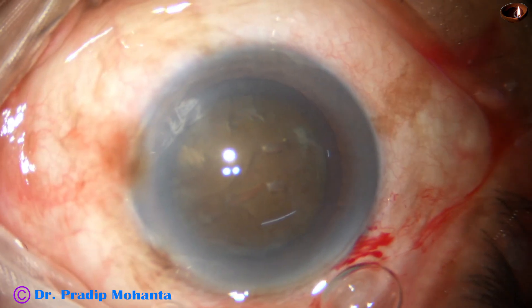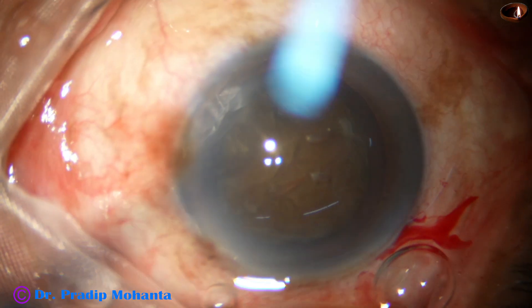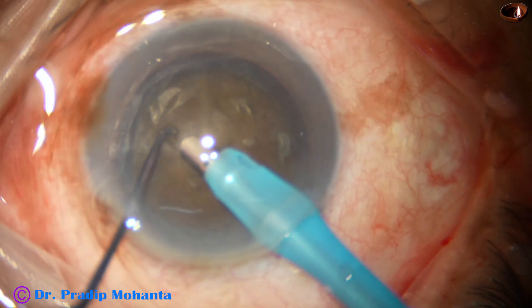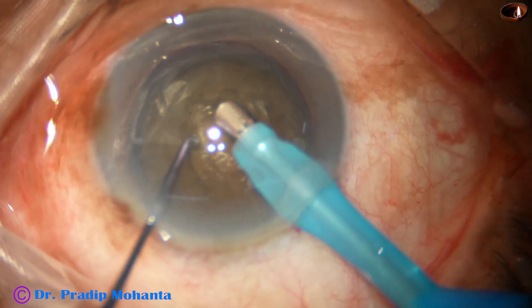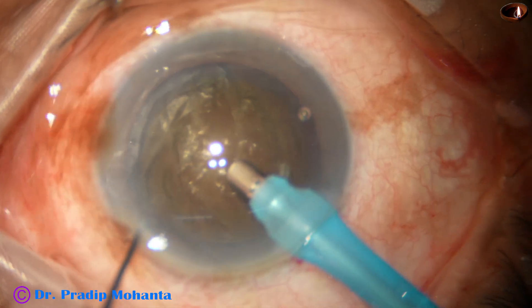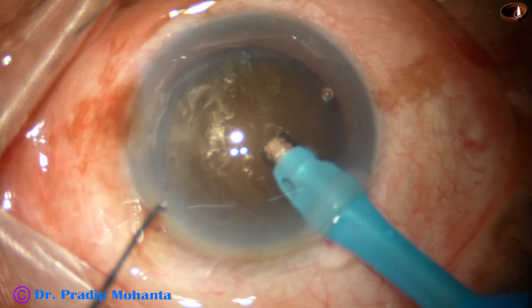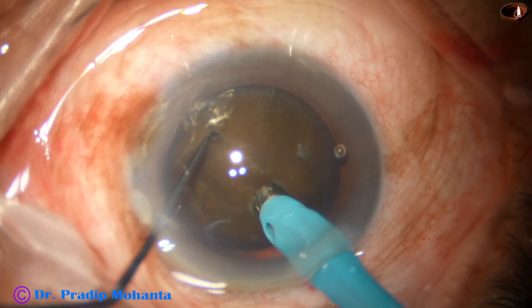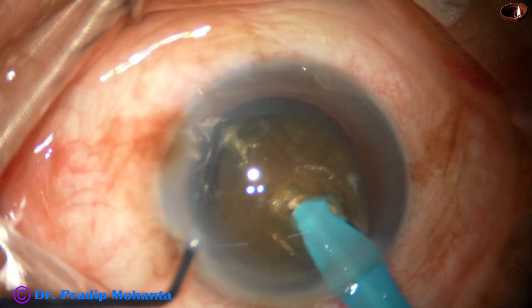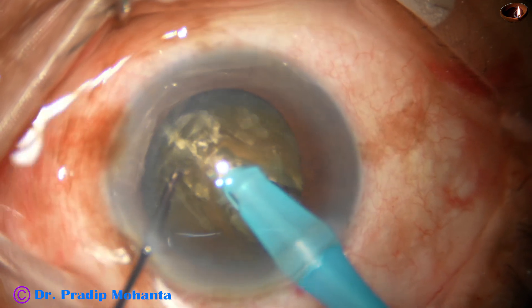Some more visco, and now is the time to introduce the phaco handpiece. The phaco needle goes in with its bevel down. Some superficial lens matter — cortex and epinucleus — is removed. Then the handpiece is turned to make the bevel up, and the tip is buried just in front of the main incision. It goes through the substance of the nucleus as a submarine goes through water — this is known as Dr. Mahanta's submarine chop.